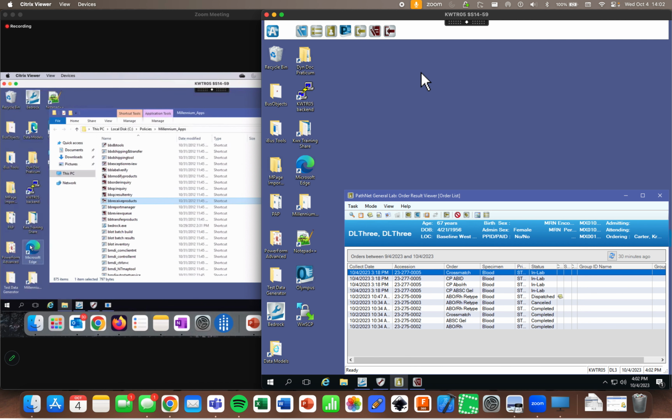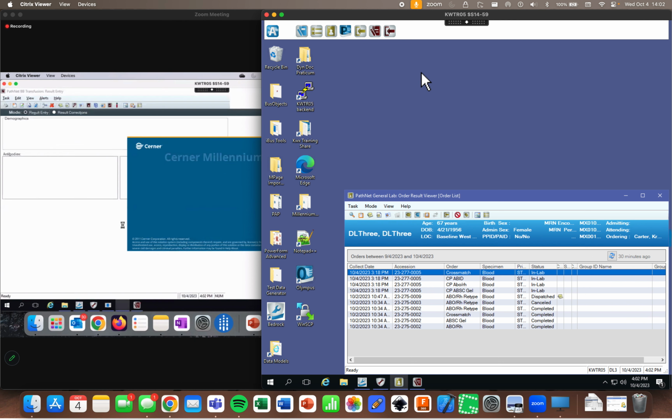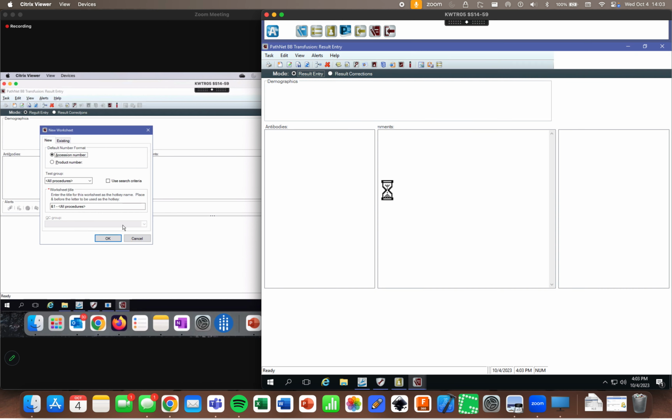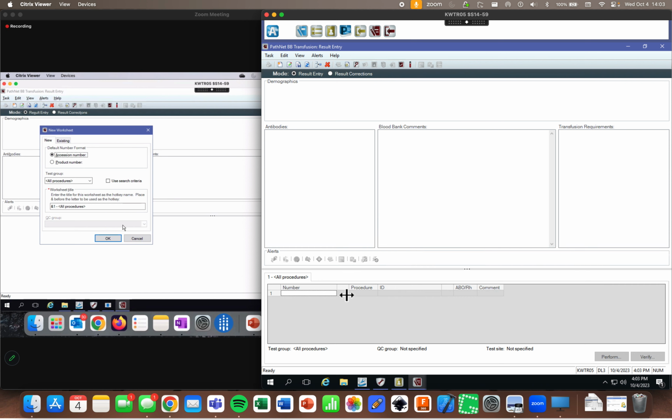We are now going to go back to result entry so that we can do some confirmation testing real fast. Because our red blood cells, when they are received, it's one of those trust but verify sorts of things where we do want to just kind of make sure that the blood that's in the bag is what it says it's on the label.